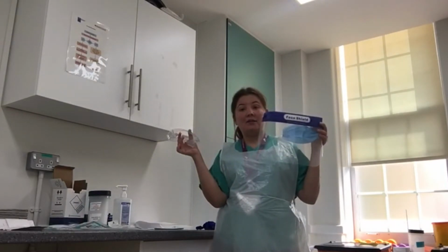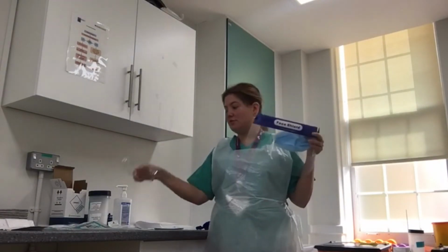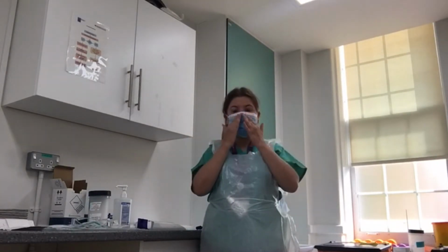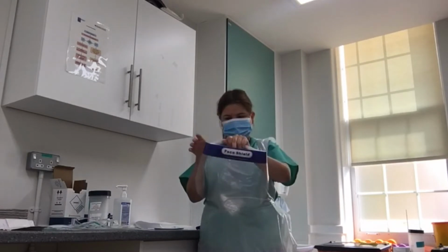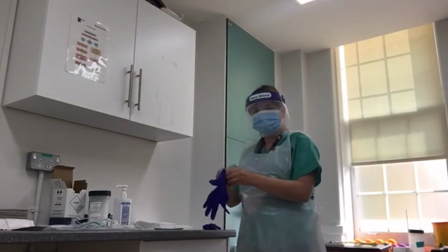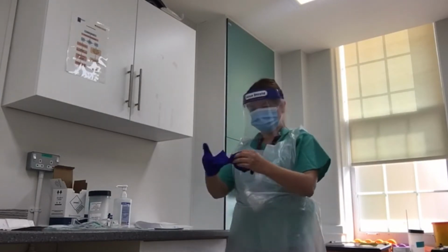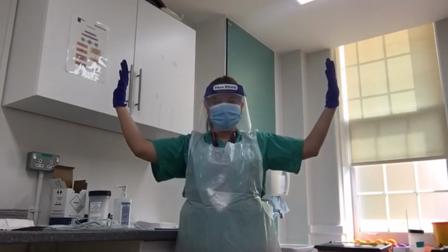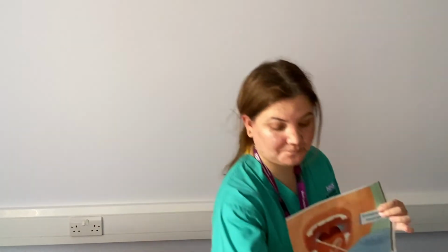We strongly recommend that you wear eye protection when taking a sample, either a face shield or eye goggles. And then you're done.